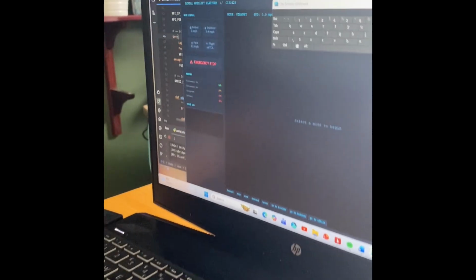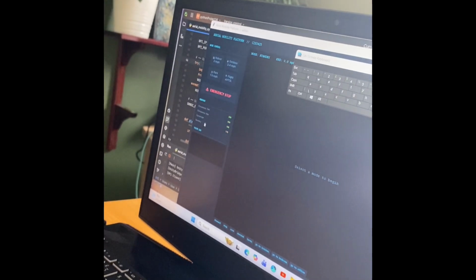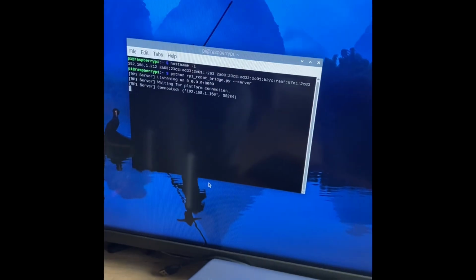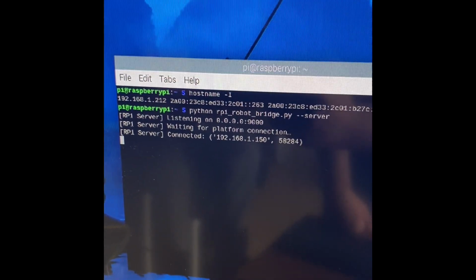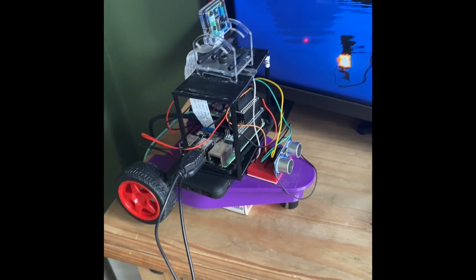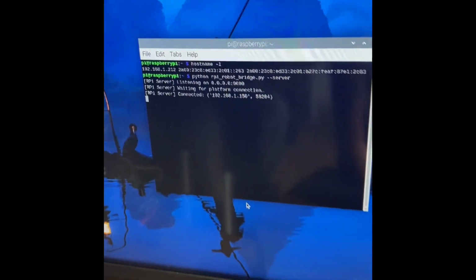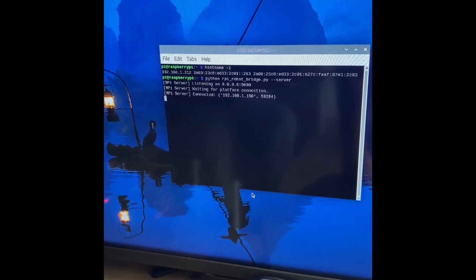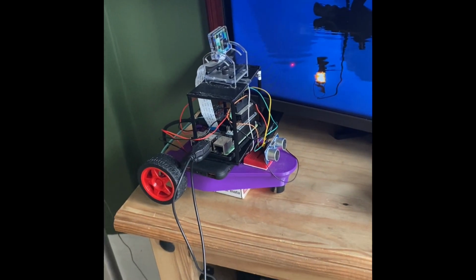So you can see it populated the username field with admin on a voice command, and this brings you into the graphical user interface. As you can see on the Raspberry Pi, it will also say connected, as the graphical user interface has connected with the hardware of the Raspberry Pi, and that should allow me to control the motors of the Raspberry Pi when I select a drive mode within the GUI, which I will show you now.